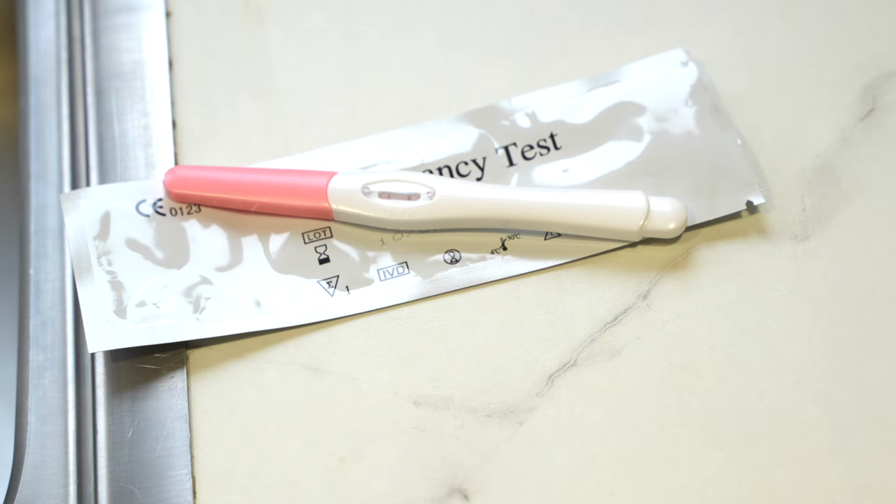Once we've dipped the urine, we're going to place the test strip on a horizontal surface and we're going to observe it for 60 seconds. In that time, we'd expect the control stripe to appear, showing that the test is valid, and then if we have the patient carrying a pregnancy, we'd expect a second line indicating a positive test result. If we're only getting 1 line, the control strip, then we've got a negative test result, and we can inform the patient that they are not pregnant at that stage, to the sensitivity of that test strip.